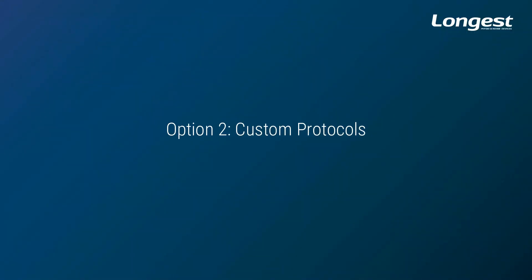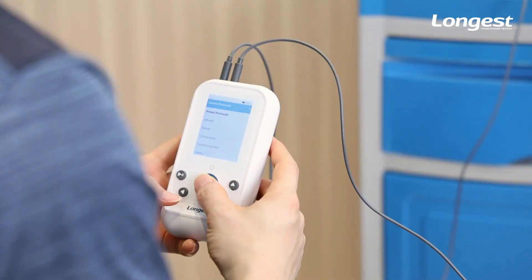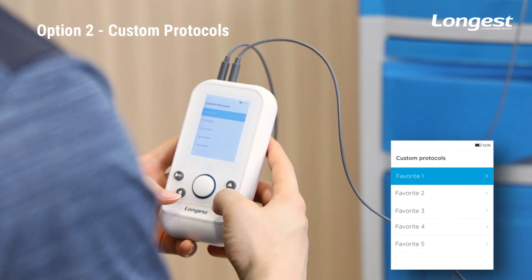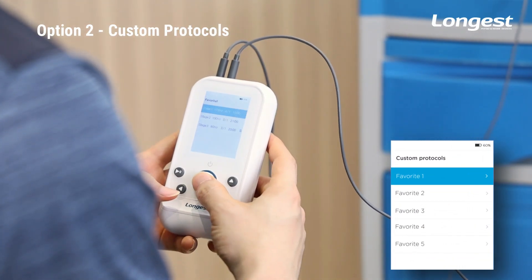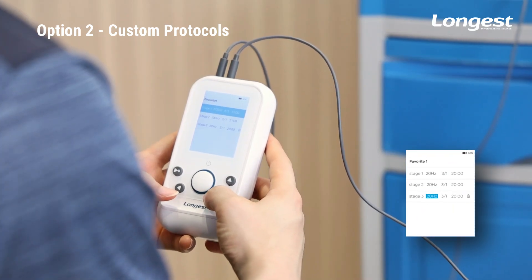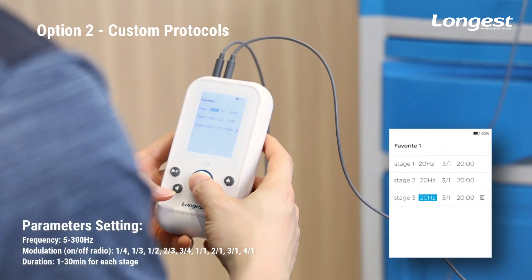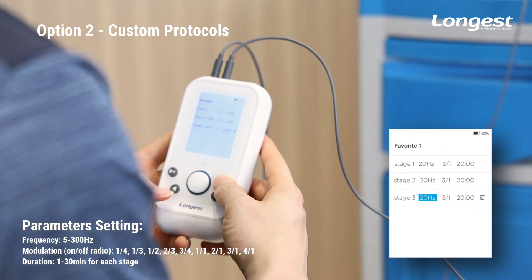You can also personalize a protocol for the patient. Select Custom Protocols — you can customize and save five protocols. By default, each favorite is a three-stage treatment. You can adjust the frequency, modulation, and treatment duration of each stage.